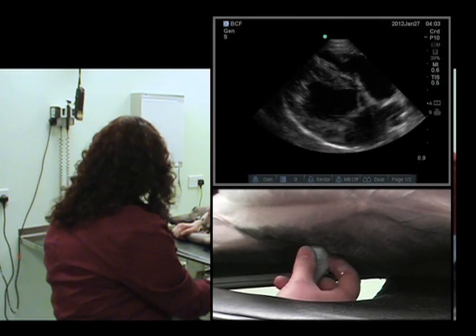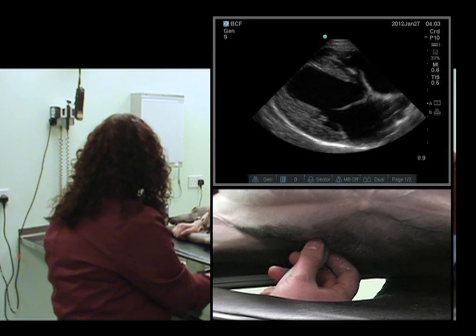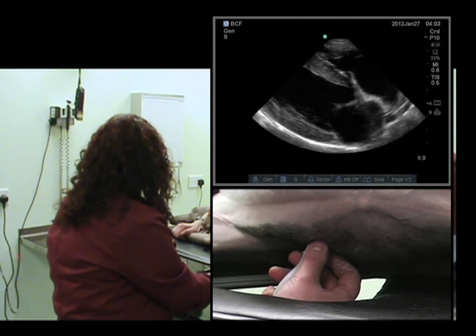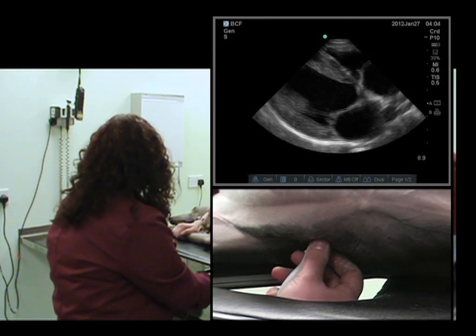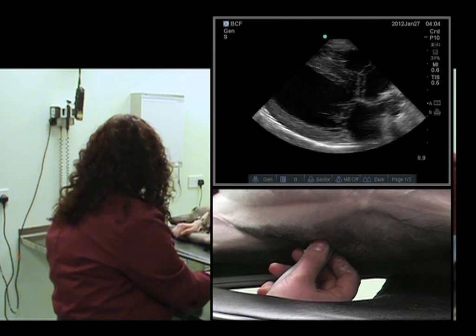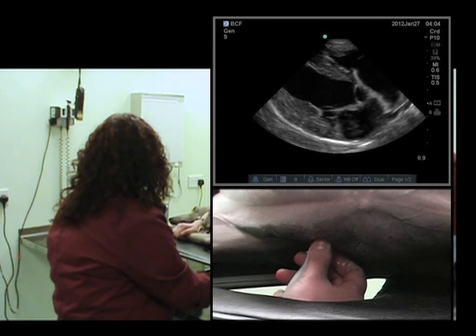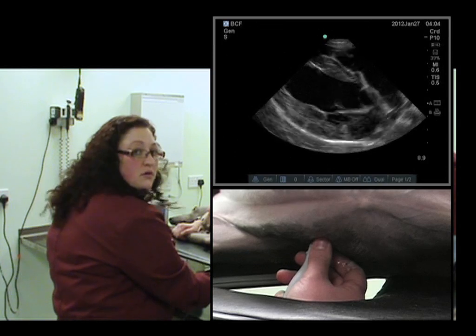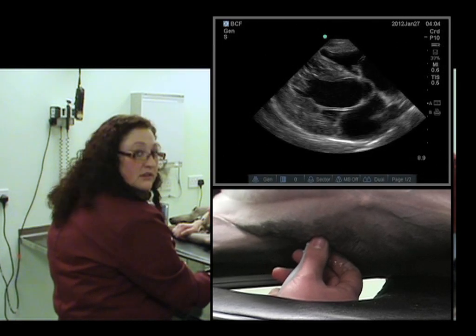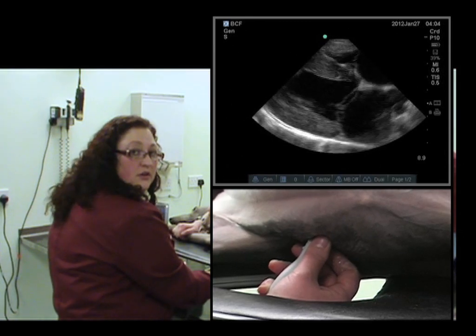Feel for the apex beat in the intercostal space, and we're nearly there. We'll rotate ever so slightly anti-clockwise, and that's looking pretty good. We can fan to improve this — that's a better view. If we fan the other way, we lose it; we've just made a very small movement. So if we fan again caudally, staying in the same orientation and the same rotation, we get a much nicer standardized view.